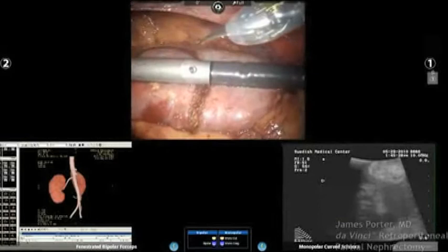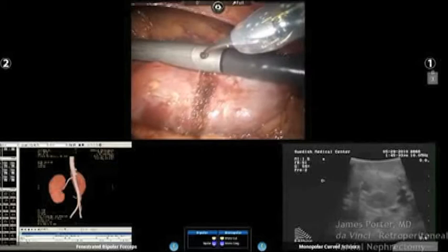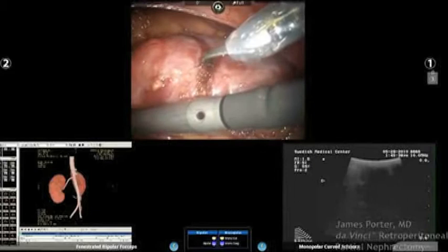So, Jim, Sam Biondi just made some comments about the lesion and its appearance on sonogram. Any concern this may be an AML because of the bright appearance on sonography? Was there any fat density on that CT? No, there was no fat on CT.